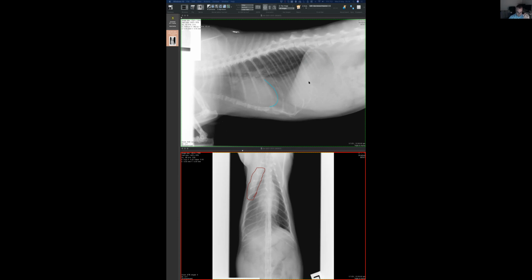What else do I want to put aside? Probably the other thing is, both of you that were pointing out nodules, they came back to the hilar region. Be very careful about the hilar region. We have big vessels there. Do you remember the grapes? It is where we have the most grapes superimposed. So you are very likely to confuse a vessel, some summation, with a nodule. If you think about nodules, go to the periphery. There's not so much lung there, and then see if you can replicate that.